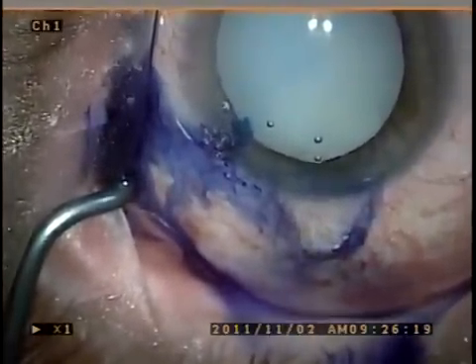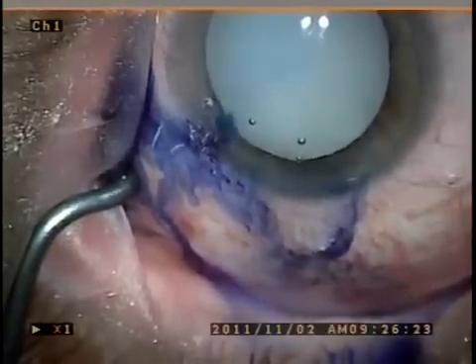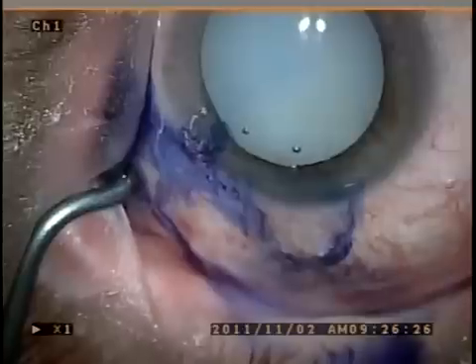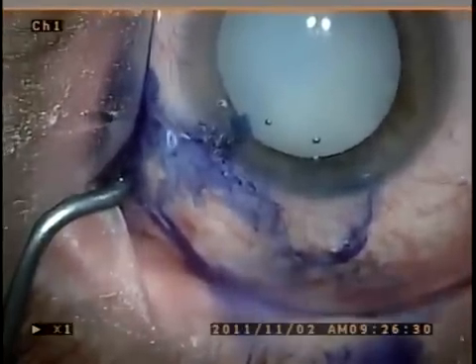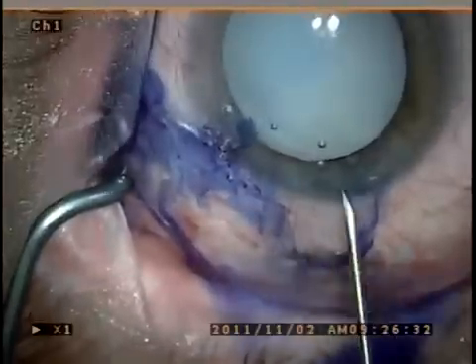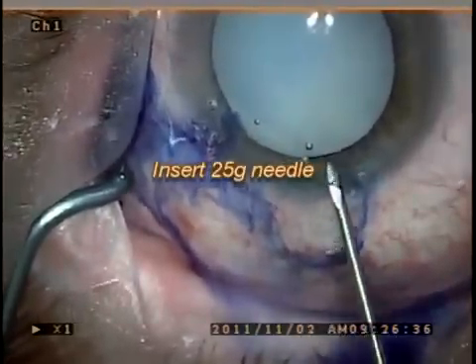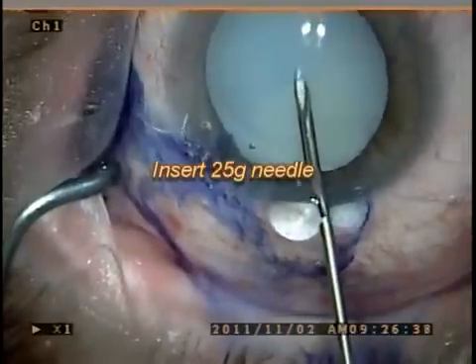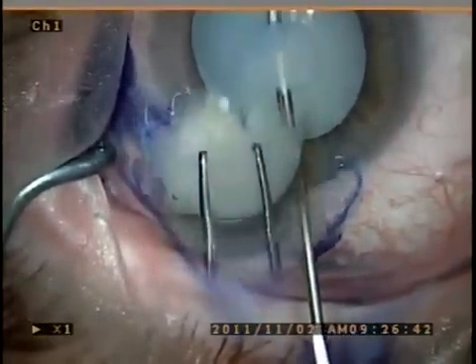What I like to do is use a 25-gauge needle to make an initial stab incision into the lens right through the anterior capsule, and at this point one can aspirate all the liquefied cortex that will come forward.